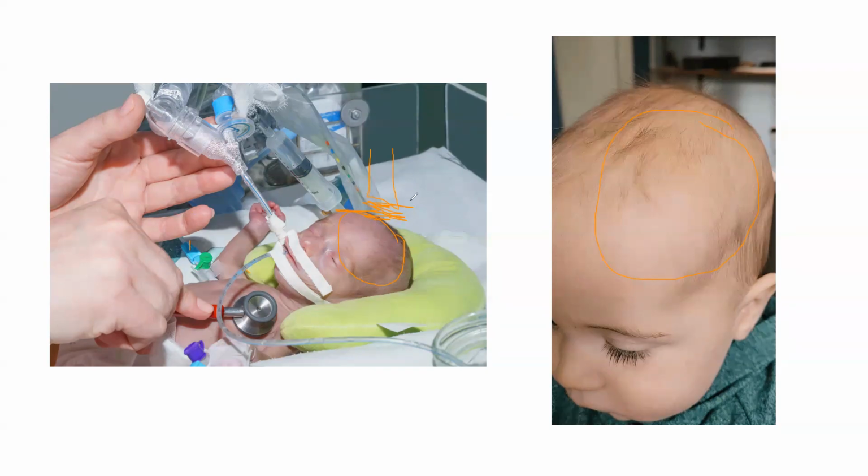And for that reason, their interaction will be with the superficial layers of the brain. Because they interact with the superficial layers and they're close together, the tissue of the brain will absorb more energy. So, for that reason, you will have better resolution because the tissue is well delineated. But because more energy has been absorbed, the deeper areas of the brain are seen with less resolution.